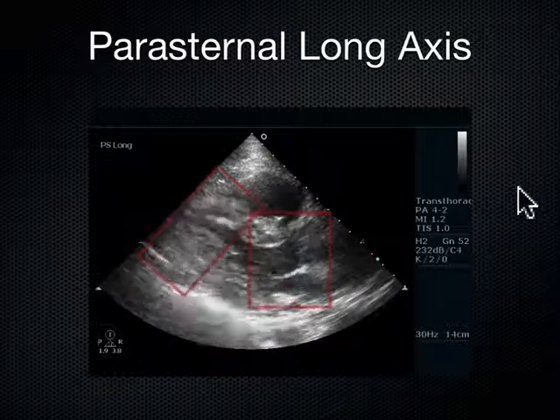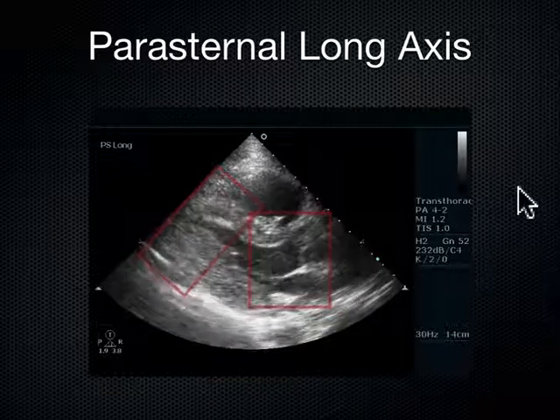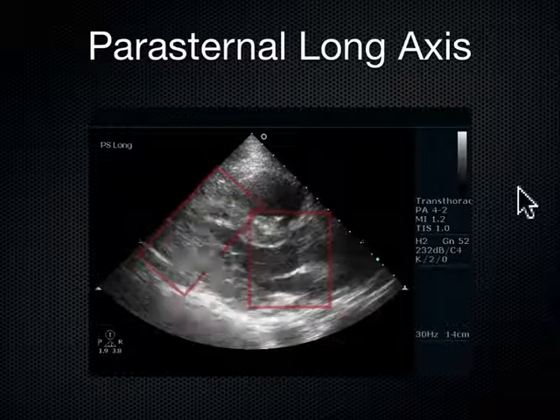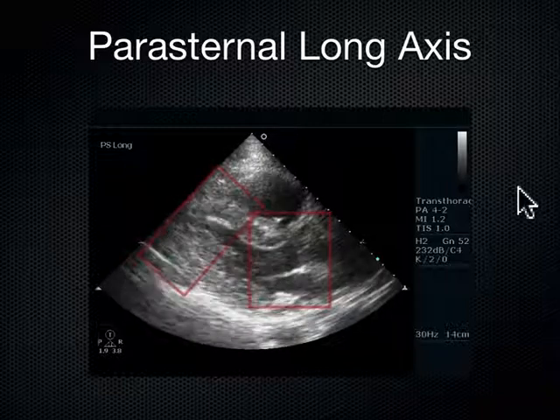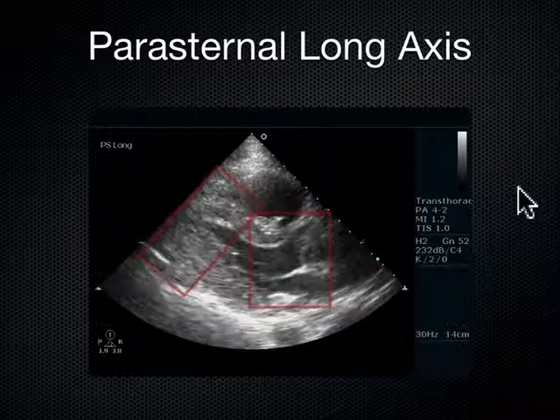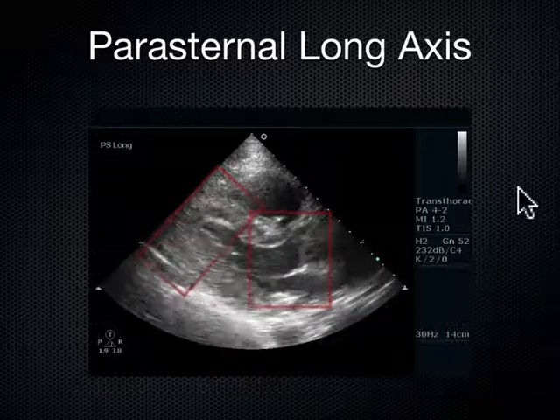Yeah, would the ratio change depending on the cross-section that you're taking, or potentially the angles? So that's a good question. How do we know that this is really, I mean, we've got this long axis through the heart. If I fan the sound from one side to the other side through this cylinderish, cone-ish thing, maybe I'm just shortening my axis, my view of it, right?